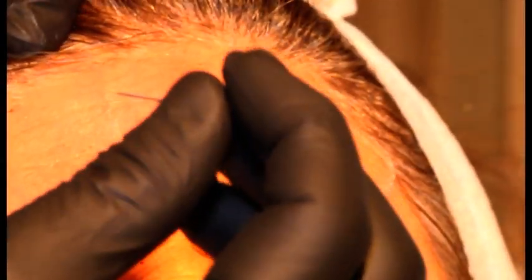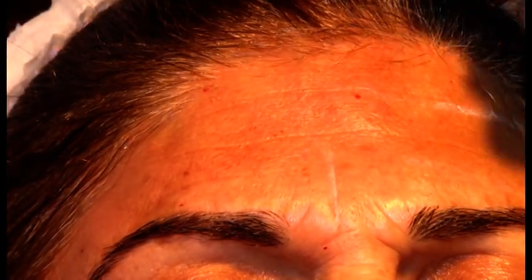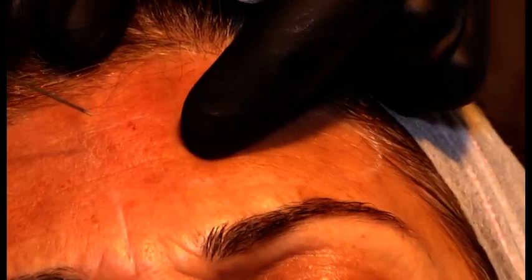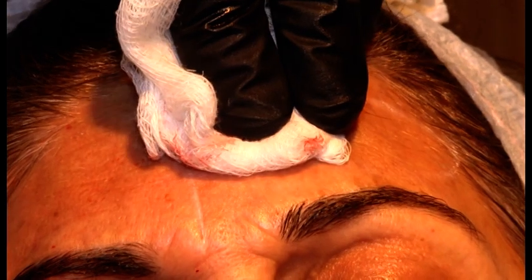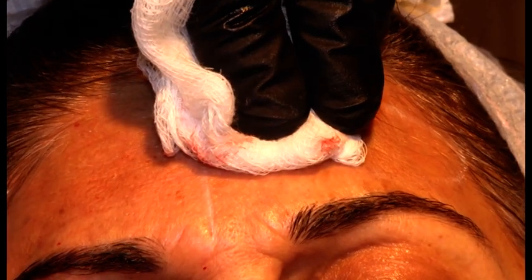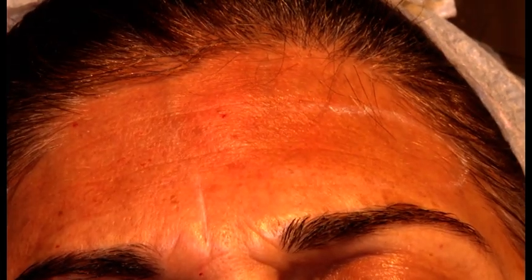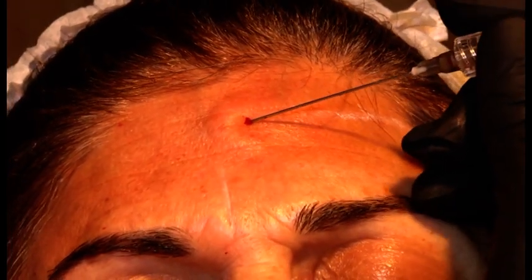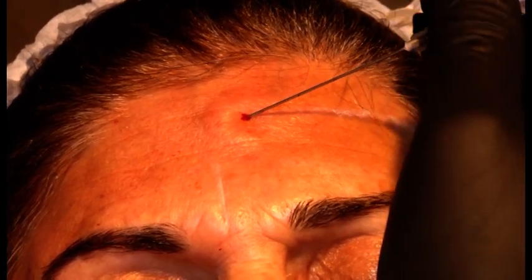Okay, doesn't matter. Can I have the syringe? Thank you. All right, can you see it like this? Yeah, you can. Okay, great. Okay, let me move this way.